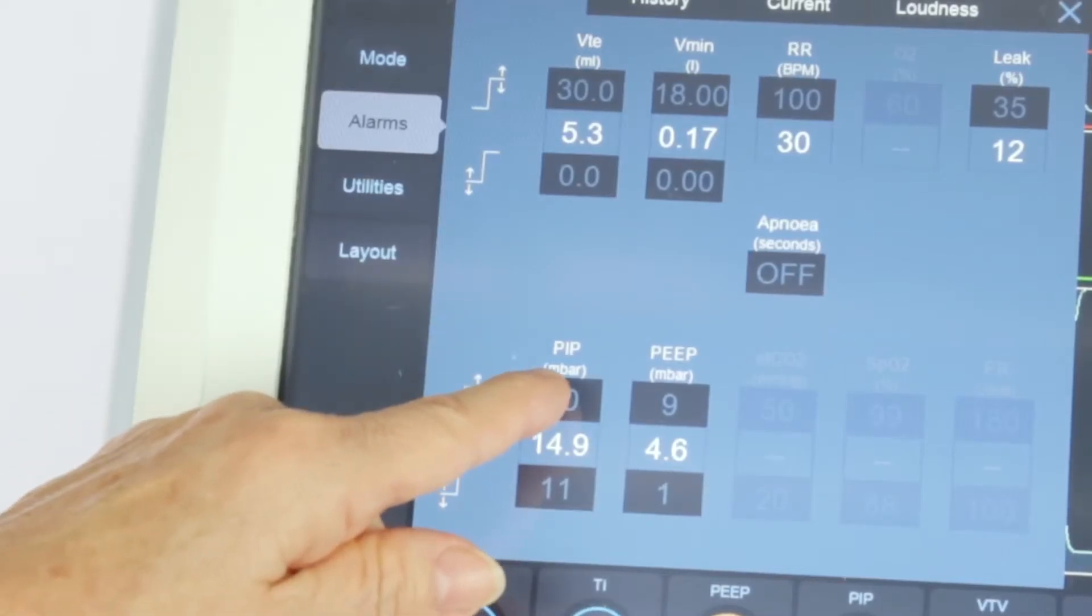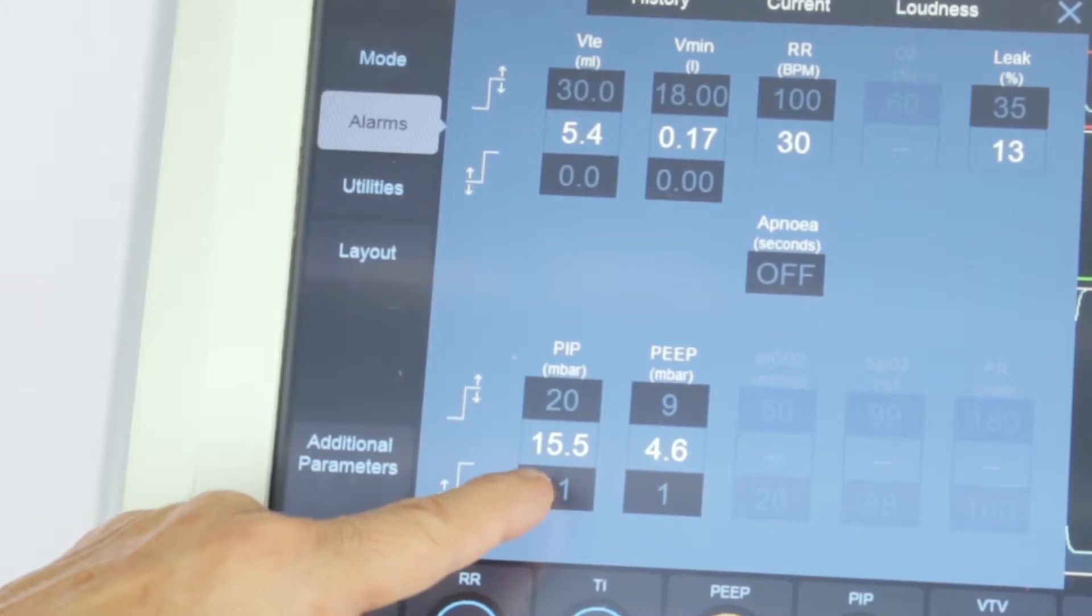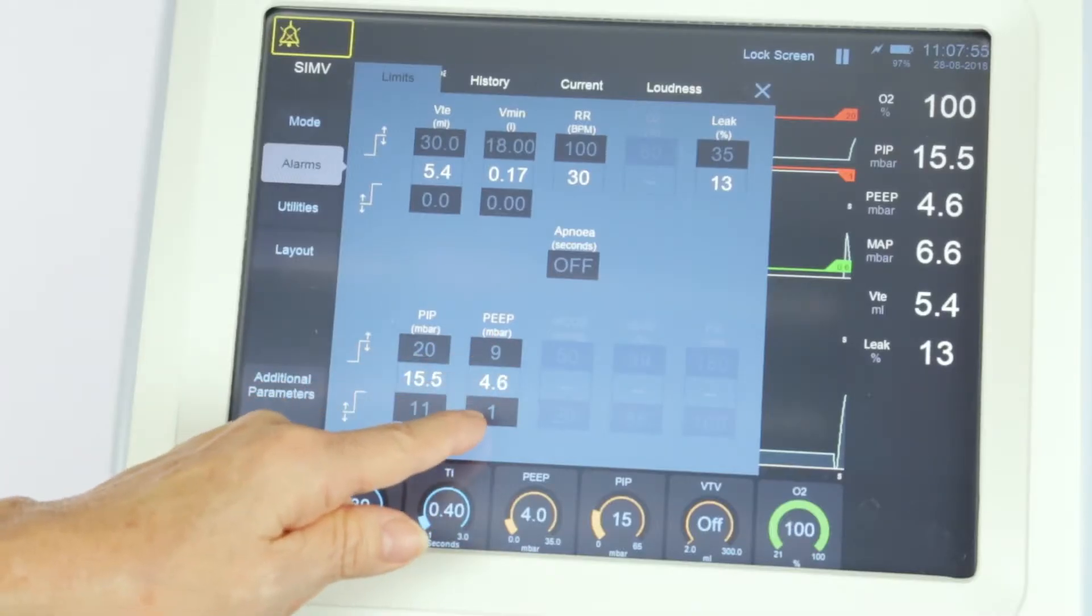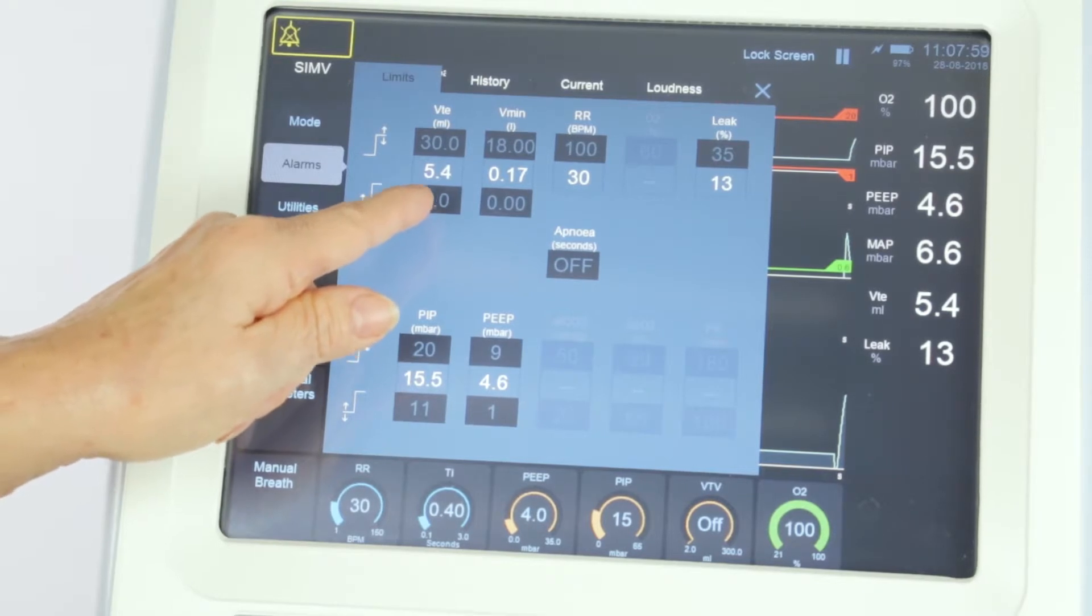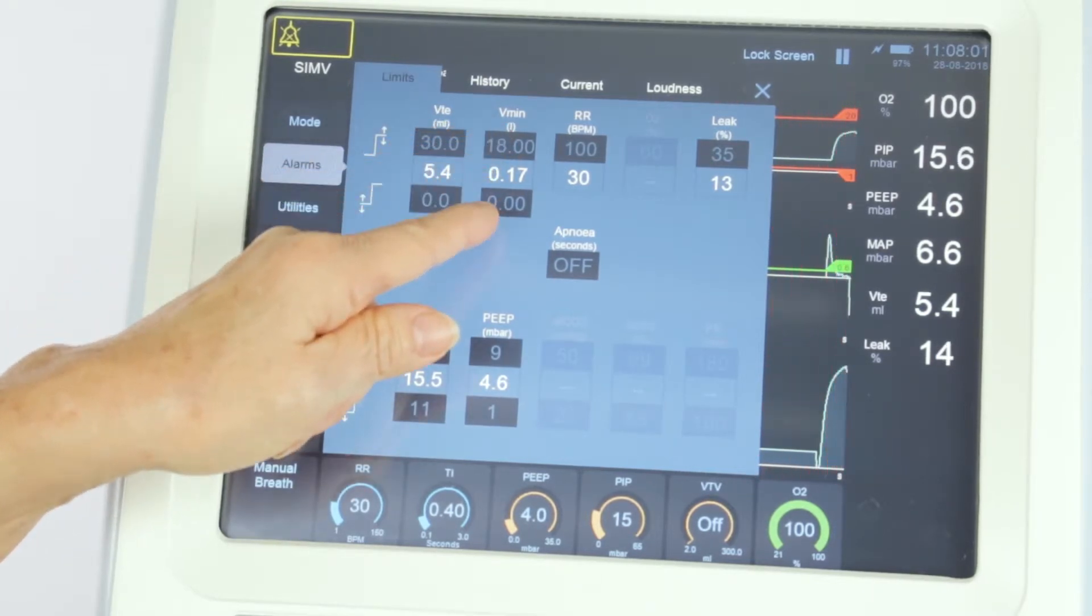The alarms to set would be high and low PIP and PEEP, expired tidal volume, minute volume, and rate.